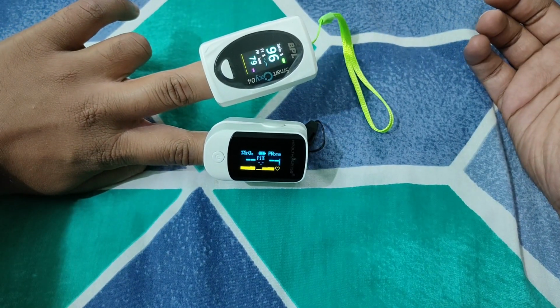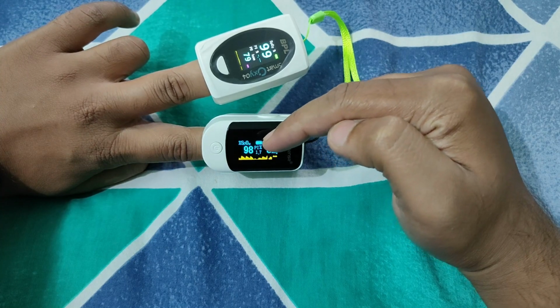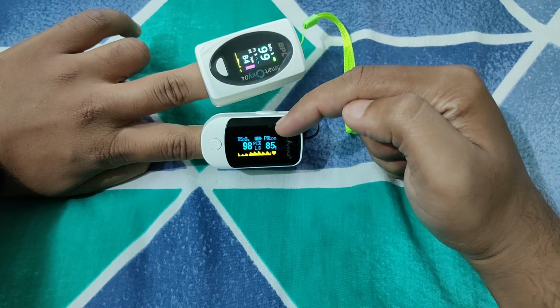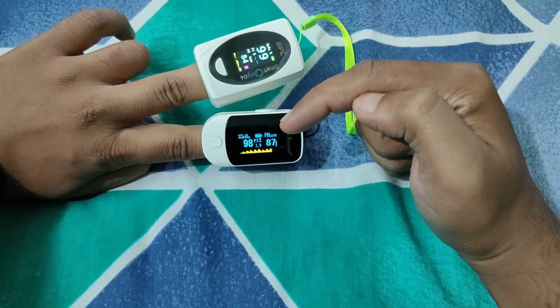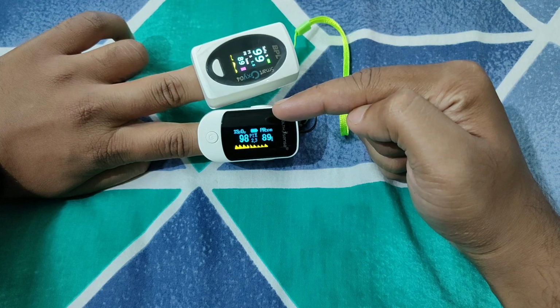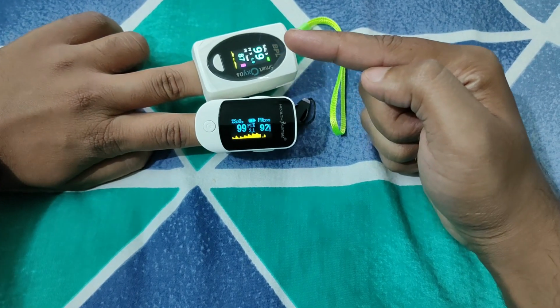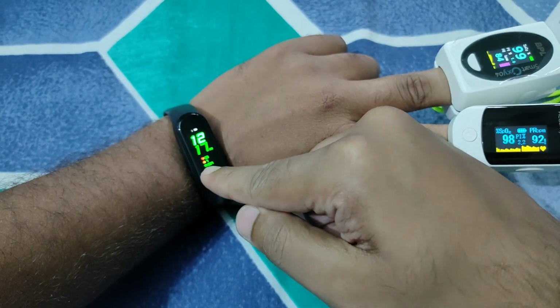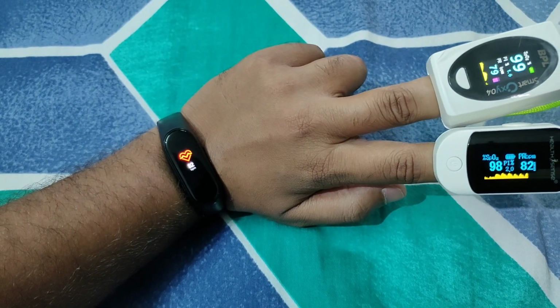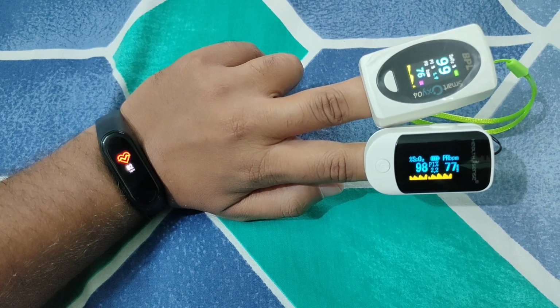You can see BPL is showing 96 SpO2, Health Sense is showing 97, 98. You can see the beats per minute, which is the pulse, is almost the same on both, and both are producing a dynamic pulse, so it's updating continuously. The results are pretty similar, and I'm also going to measure the pulse on my Mi Smart Band. Let's switch on the heart rate sensor, and you can see it's showing 82, which is very close.